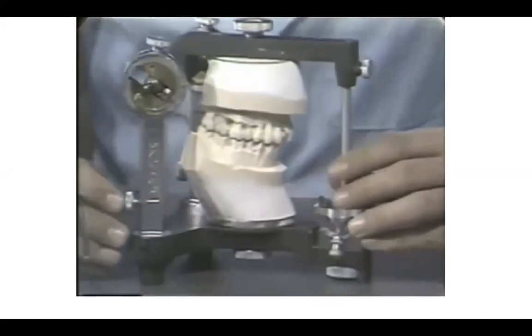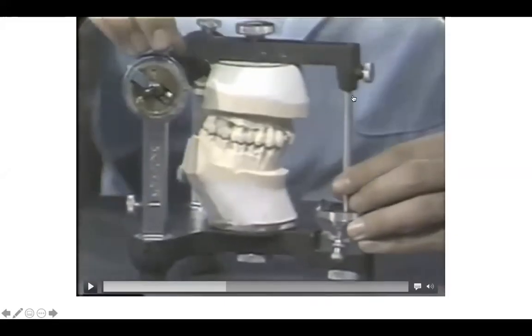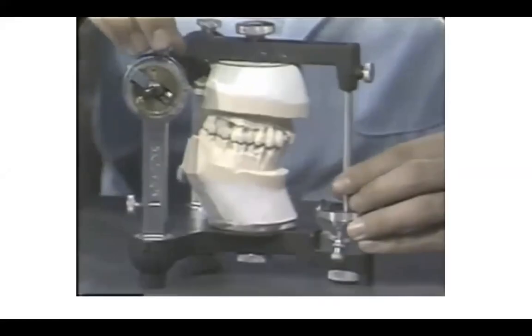Here, I would ask you to focus on the fact that we have an incisal pin and an incisal guidance table. So these are two different things. The incisal pin is considered to be attached with the upper member of the articulator, although it's removable with the help of a screw, while the incisal guidance table is attached with the lower member of the articulator.